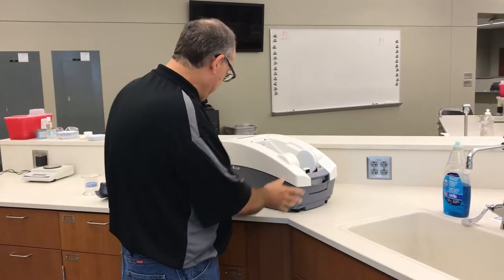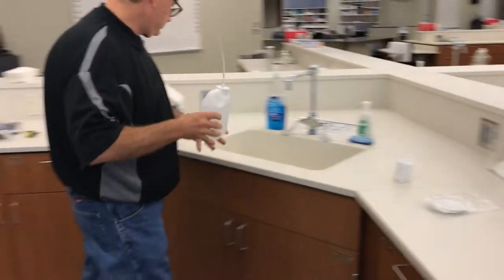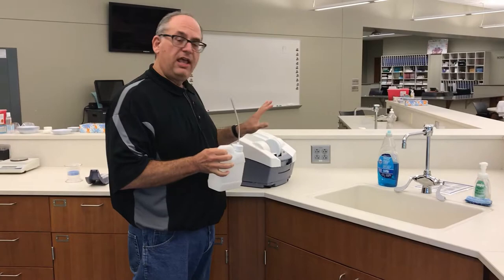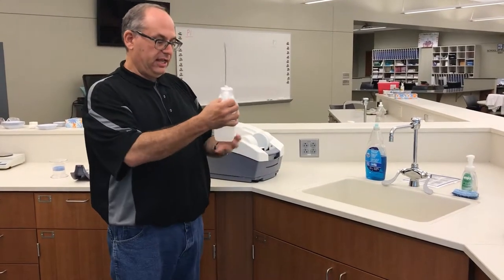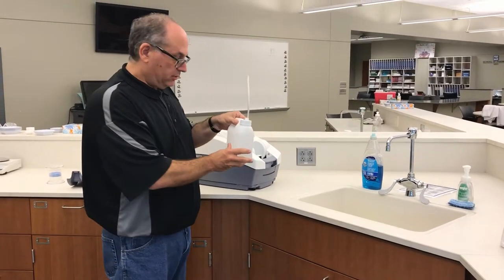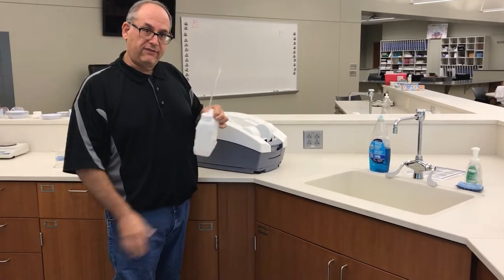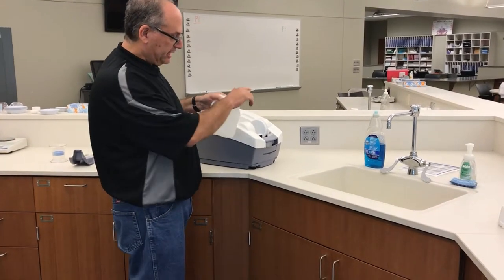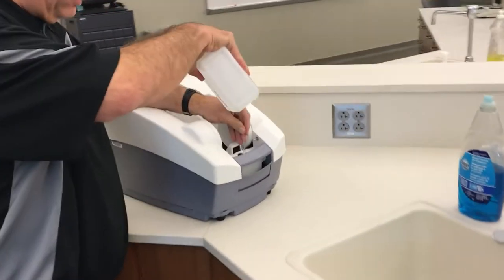Now the machine is empty. To add water — if the machine says there's not enough water or you need to change it — I've already filled a container with distilled water. To get it down into that small opening, you may want a funnel or something with tubing on it. I'm going to put the tubing in and hold it up so the water flows in.